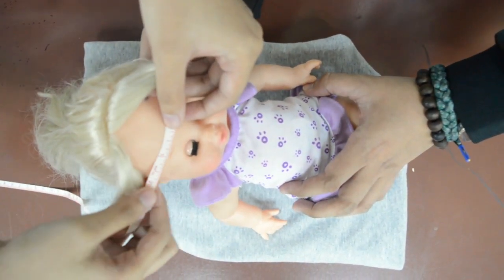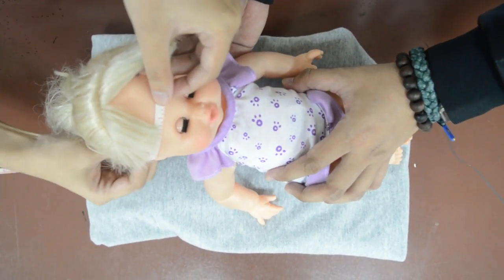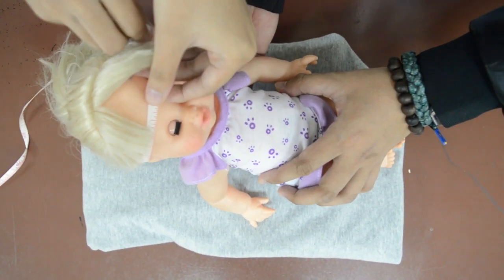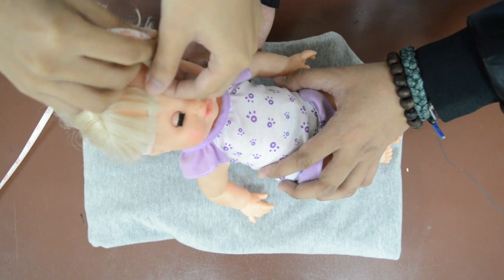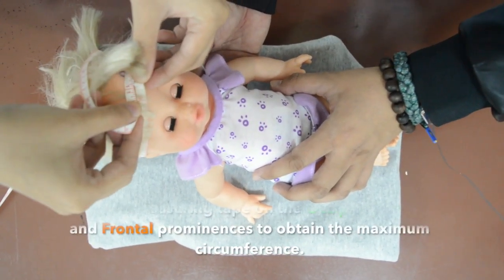Large head size is macrocephaly, which may result from hydrocephalus, subdural hematoma, or rare causes. To measure the head circumference, place your measuring tape over the occipital, parietal, and frontal prominences to obtain the maximum circumference.